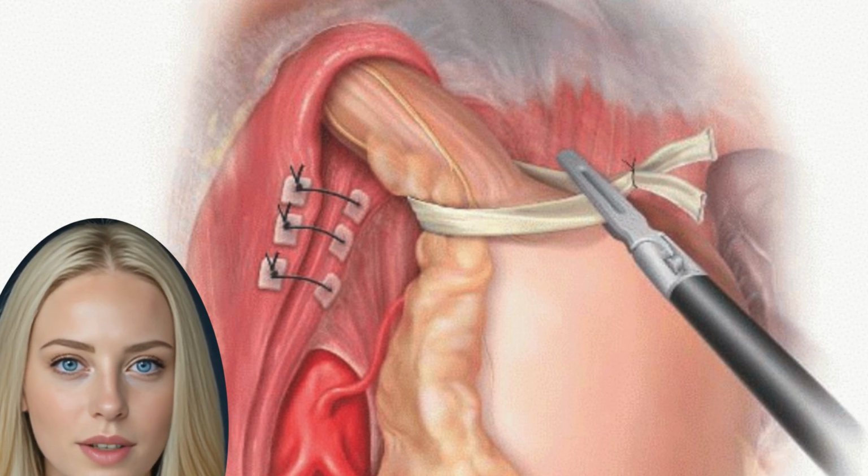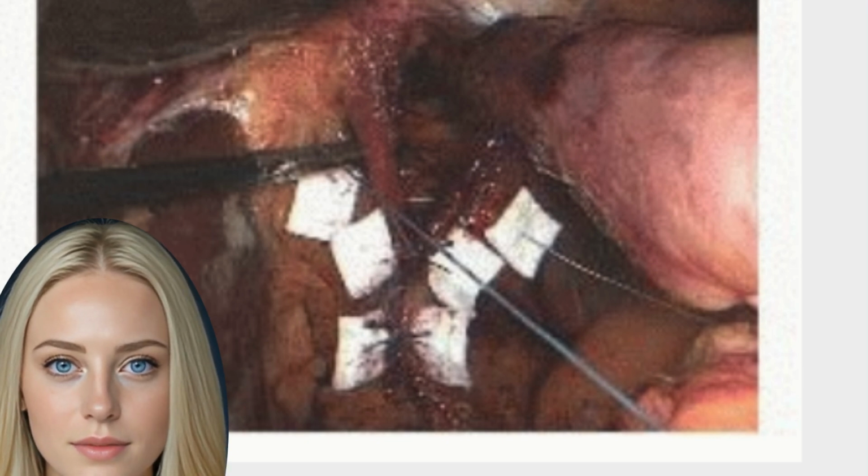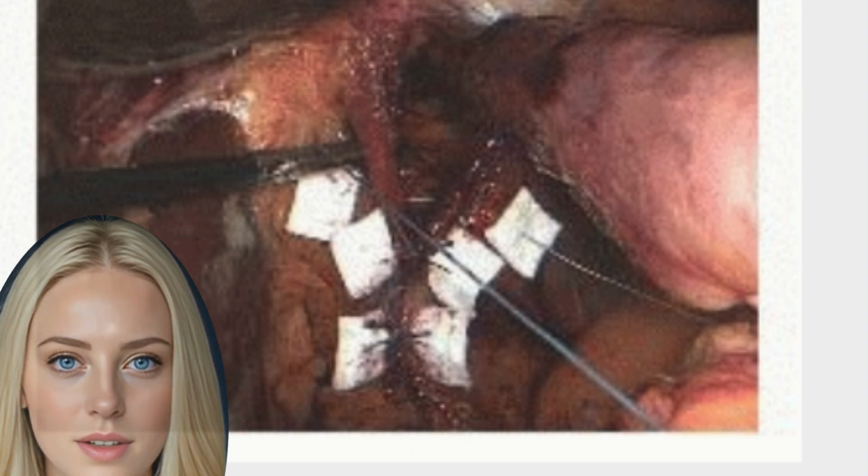Fig 13A-B, excision of the hernia sac off the anterior esophagus. The sac is placed under countertraction and bivalved just to the left of the vagus nerve. Fig 14A-B, demonstration of proper range of proximity to the esophagus during ultrasonic dissection. A, view from left, near esophagus. B, view from right, approaching endothoracic fascia and pleura.